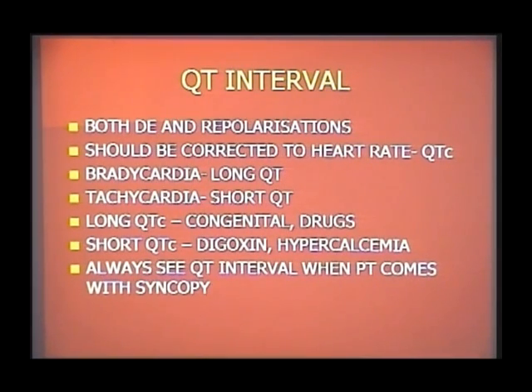The importance of QT interval is that whenever a young person or child comes with syncopal attacks and also fits, don't always think it is epilepsy. Many times it may be due to long QT syndromes, which produce dangerous recurrent ventricular arrhythmias and Stokes-Adams attacks, which will be the cause of syncope and fits in children. In children and young adults, whenever there are fits and syncope, look at the QT interval. See whether it is long, whether it is producing a dangerous arrhythmia. Many times, the majority of these long QT syndromes are treated as epilepsy without looking at the ECG and the QT interval. So always remember that.